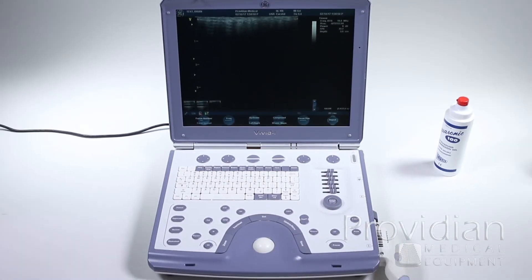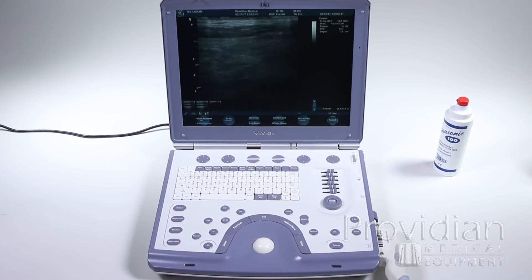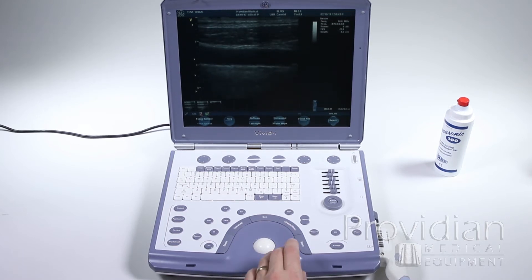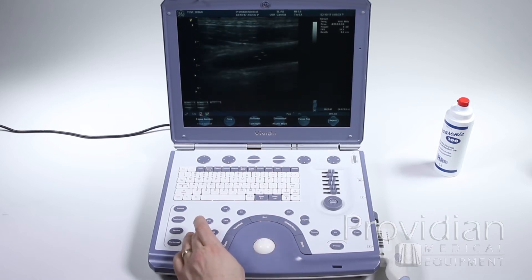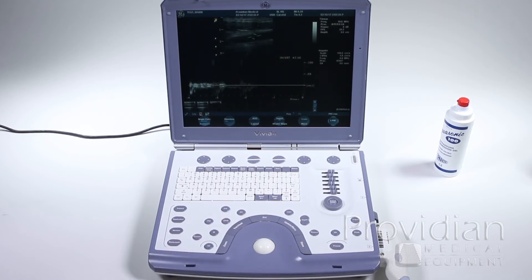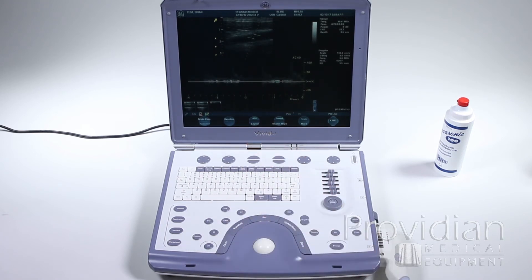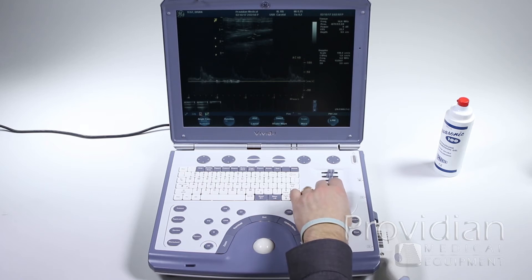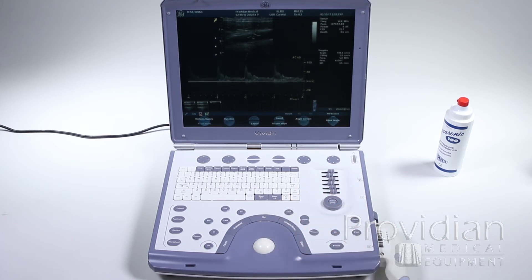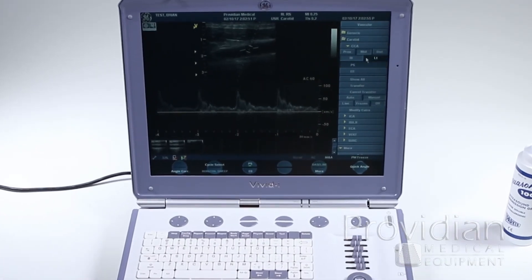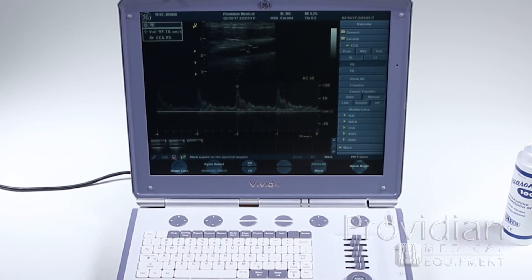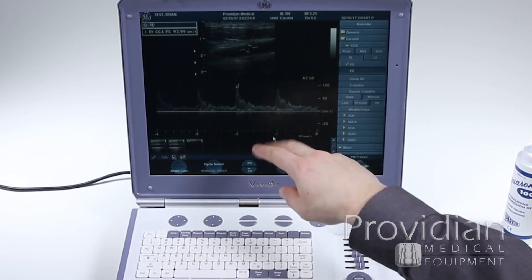Moving on to Doppler measurements. Get the cursor and hit PW to get a full Doppler image. Invert that, then select ASO for auto. Freeze the image and hit the measurement button. Choose mid, right, peak systolic — and pick it right there. It will show a 1 next to it. Hit the set key; if you don't see a 1 or a result, something's wrong.